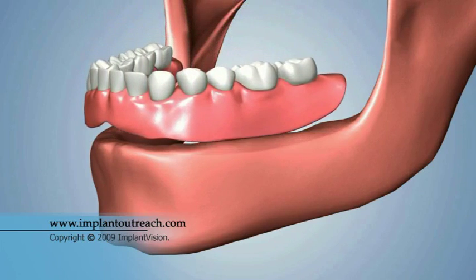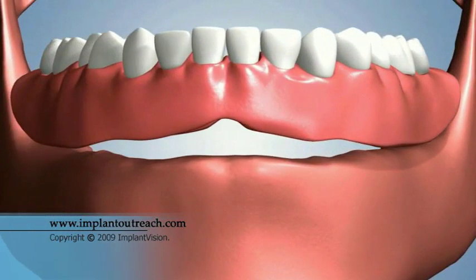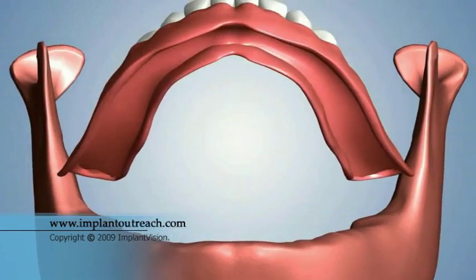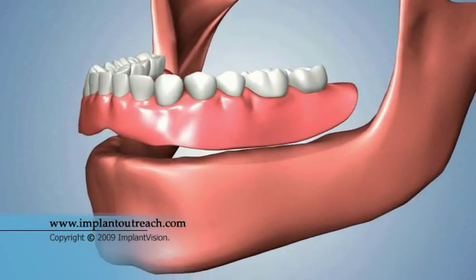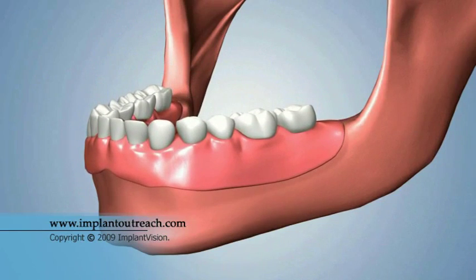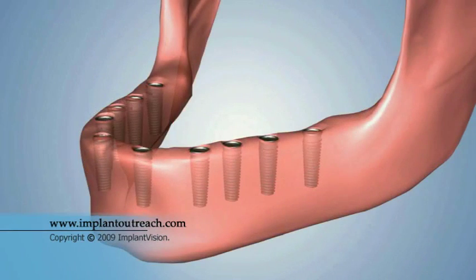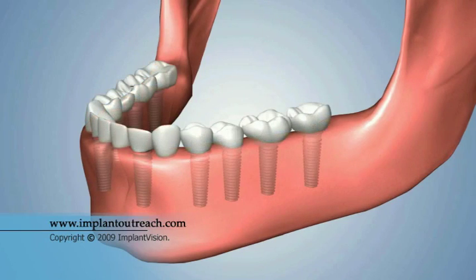One option would be the placement of a removable denture. A denture sits loosely over your gums, with no secure connection to the jawbone. Another option would be choosing a dental implant-based treatment. Implants are secured to the jawbone, replacing the function of your natural tooth roots.